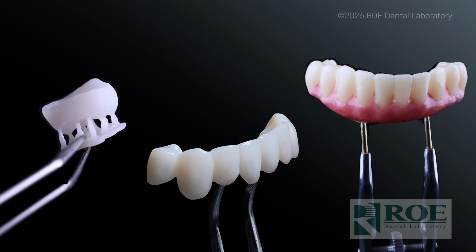And the amazing part about this, because I know some of you are saying, okay, this is going to take too long. There's the economics of scale. So the amazing part about 3D printing and additive manufacturing is the time it takes to do one restoration is the same time as it takes to do 24 restorations if it's on the same build plate. So what this allows us to do is the more units we are doing, the easier this workflow becomes.